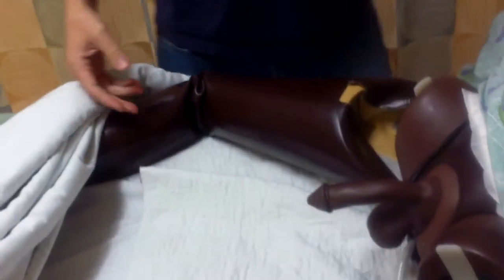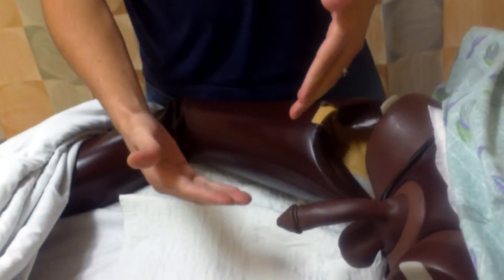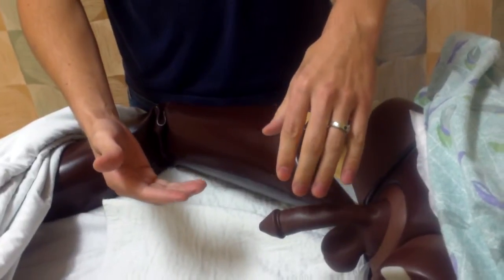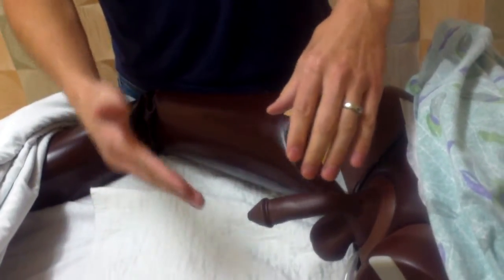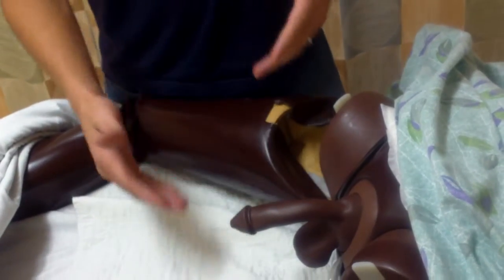Alright, I would have gloves on, obviously, and I would start from the tip of the meatus, retracting any foreskin, and doing a circular motion then down the shaft, making sure that it's clean. And then after that, I would start with the straight catheterization on my patient.